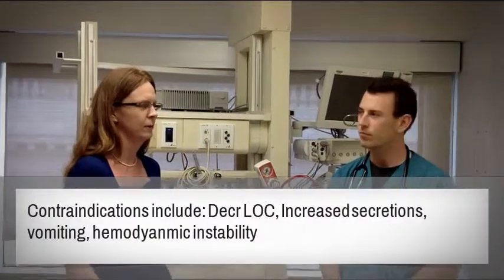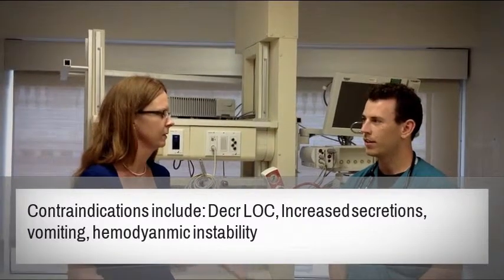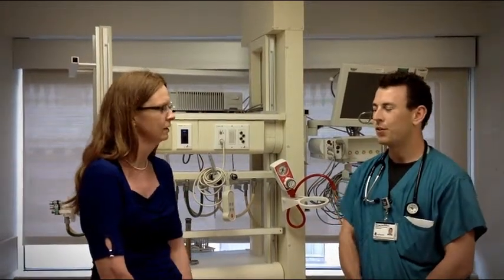So can I use it in everybody? Let's say I just don't want to intubate somebody. Can I just put BiPAP on them? It's the same thing, right? As CPAP? Or no, as being intubated. So having the breathing tube down into the lungs gives us more control over their minute ventilation and respiratory rate. Pretty much we have entire control over their breathing. With a BiPAP, they still are able to breathe on their own, and the BiPAP is there just to help a little bit, as opposed to the ventilator doing most of the work.